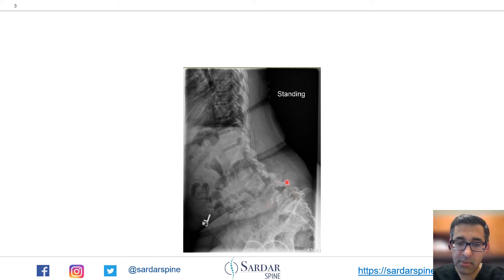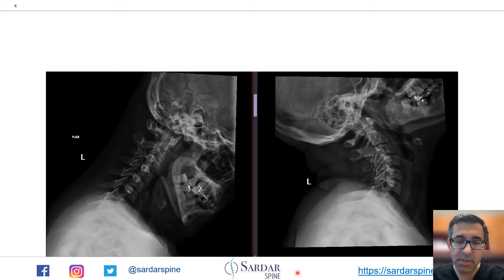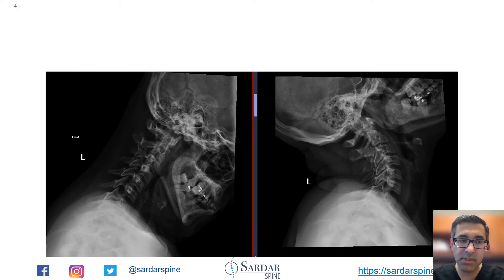Here's a close-up of the lateral x-ray of the lumbar spine. You can see the grade 3 spondylolisthesis at L4-L5 going into kyphosis, and you can also see that at L5-S1 there is quite significant degeneration of the disc and disc space collapse. The patient had rheumatoid arthritis, so we also got flexion-extension x-rays of the cervical spine, which did not show any instability.